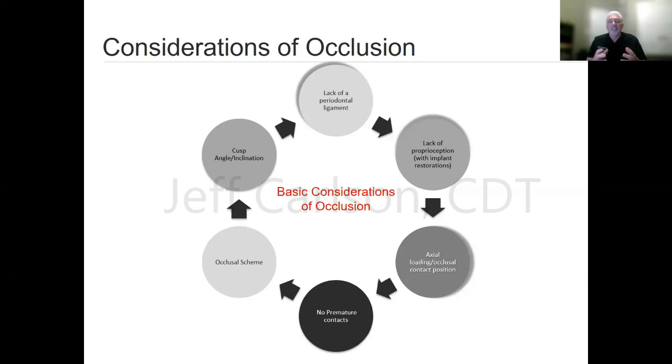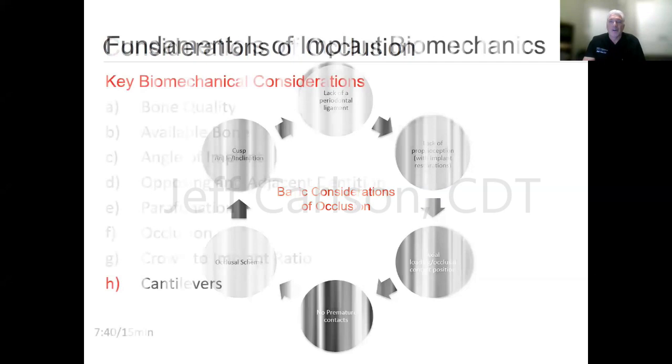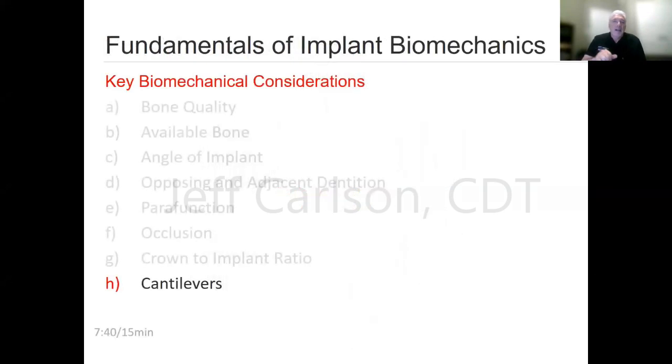In your overdentures, again, you want to try and design the occlusal anatomy not too deep, yet you don't want to necessarily go with all flat planes either. So again, working with a good laboratory, your smart removable implant technicians will know how to help select the right denture teeth for your prosthesis.